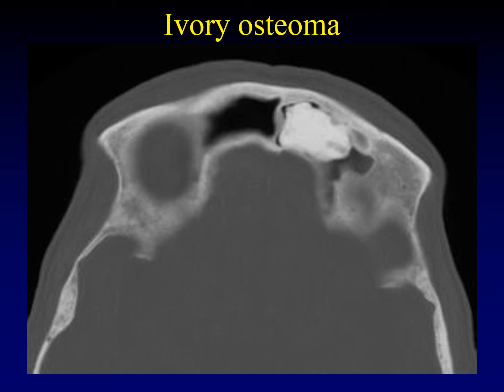Ivory osteomas are what you're probably used to. They are composed of dense cortical bone — the whole thing is just dense cortical bone — here seen filling a frontal sinus.